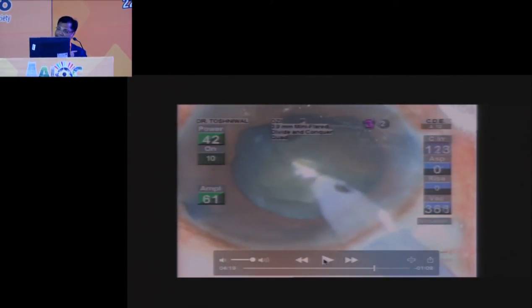What Ragini madam has mentioned perfectly, that you should have an apex in front. Now when the whole piece is there, you are away from the cornea. Here the technology counts, here the machine counts. It's a Kelman tip and it works torsionally. It works horizontally.